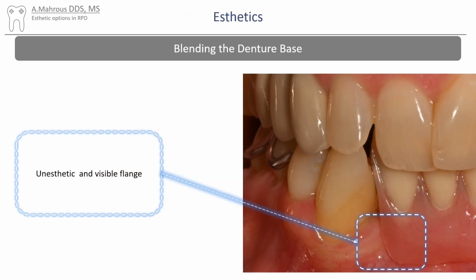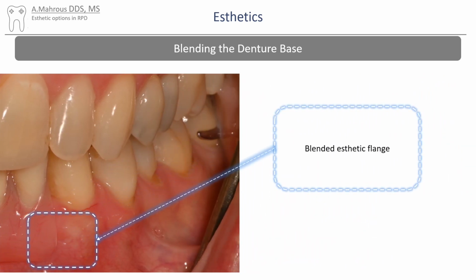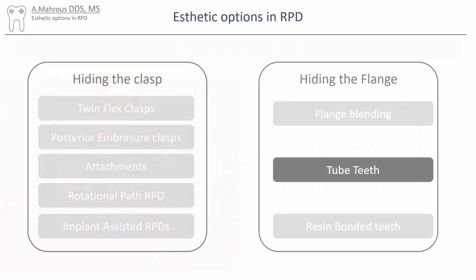Another example is this case, where on this side of the flange, the transition is very noticeable, mainly because of the thickness of the flange and how far away from the underlying soft tissue it is. However, if we move on to the other side of the flange, we'll see that this side has been perfectly blended. This is achieved by making sure that the edges of the flange are thin enough to allow some translucency, and by making sure the edges of the flange are close enough to the tissues so as to have no shadows highlighting the transition of the flange to the tissues.